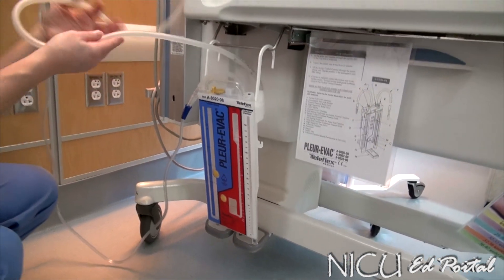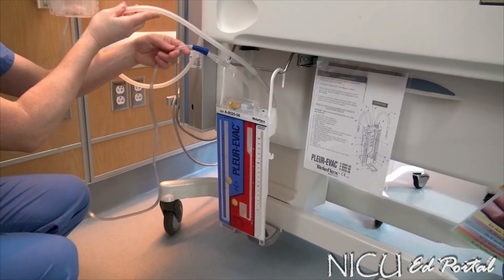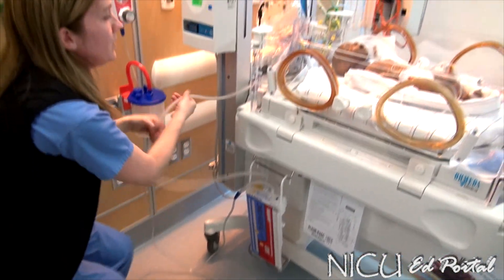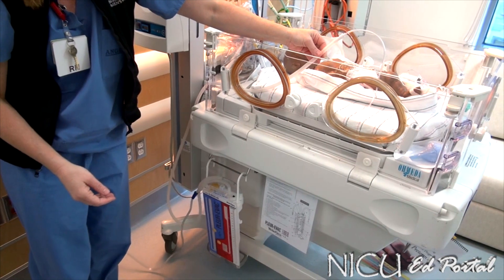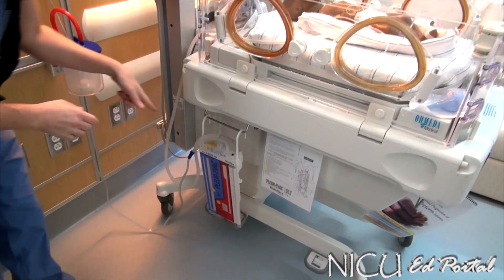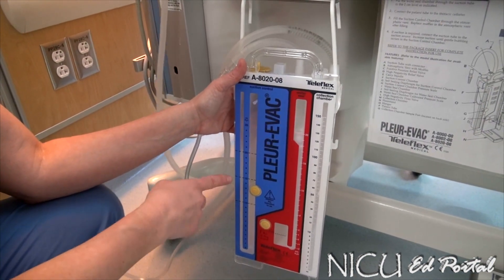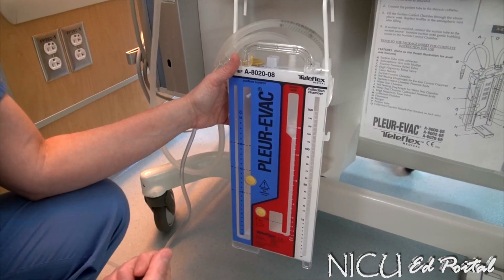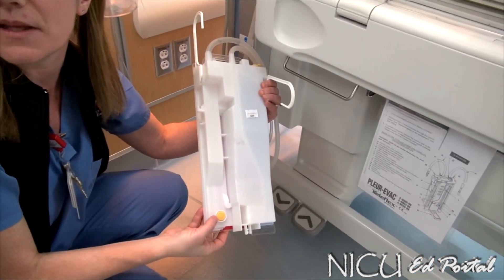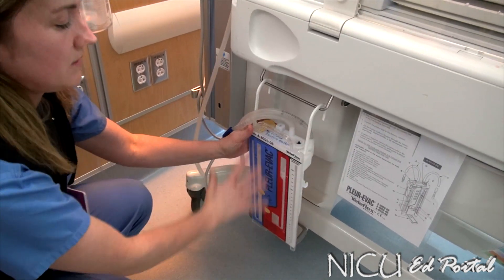The ports to this are labeled for teaching purposes, but when you open up your package, it's not labeled. This port here is what goes to the wall suction. This port is what goes to the baby and connects right to the chest tube. Those are really the two ports that you need to make sure go to the right connections. You can also inject more water or pull off water if there's evaporation over a few days. There's also a place in the back where you can draw labs if you need to send fluid off to the lab.